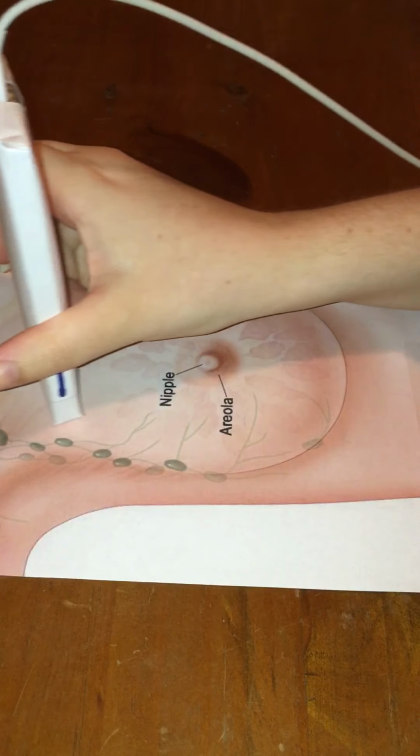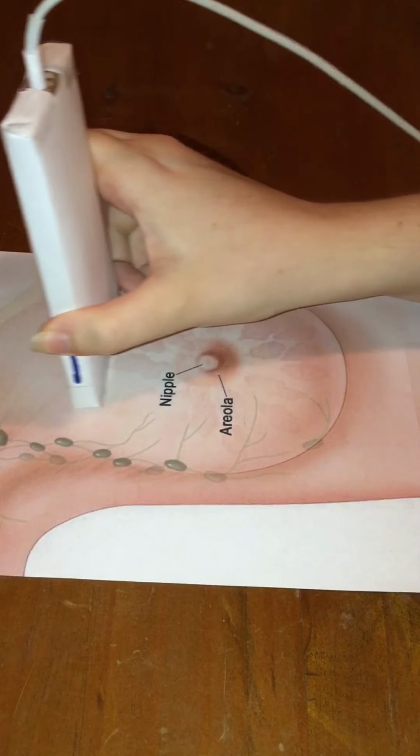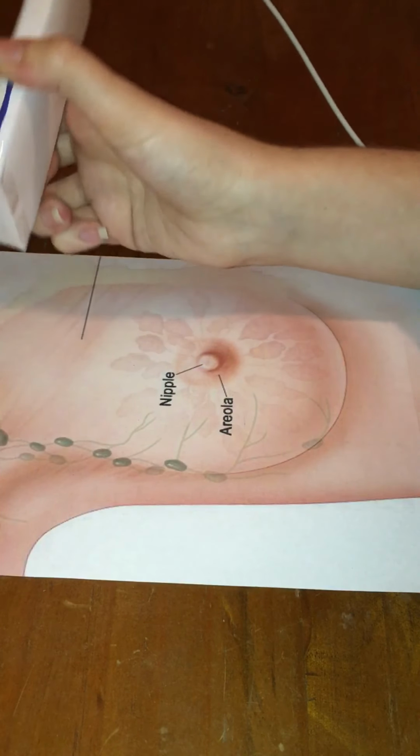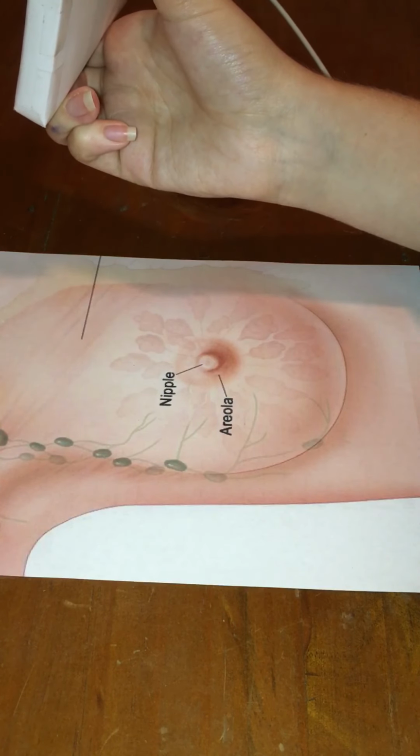The anti-radial survey would be repeated for a second time in a clinical setting, but as this is a demonstration, I'll only be doing it once, and I also move the transducer a lot faster than I would in a clinical setting.